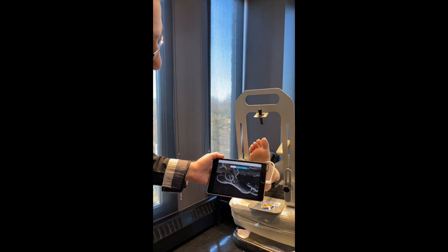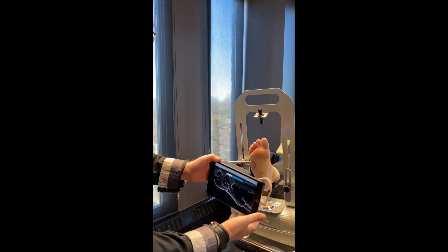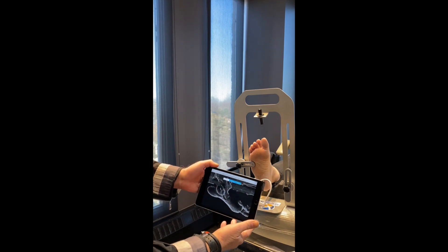It's made the process much simpler. We can see that it's very portable and very easy to use.